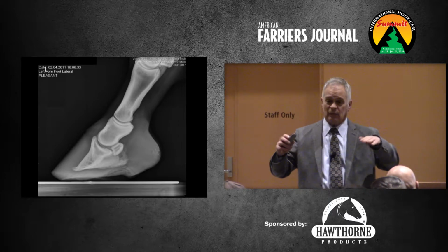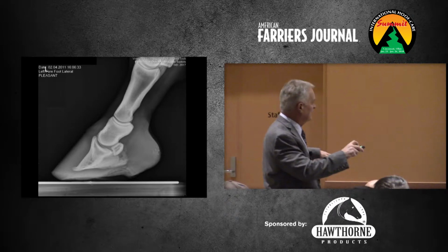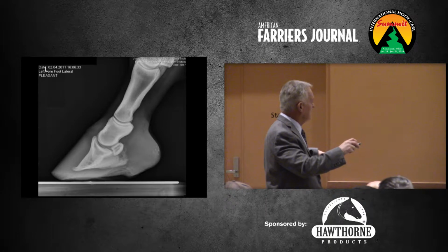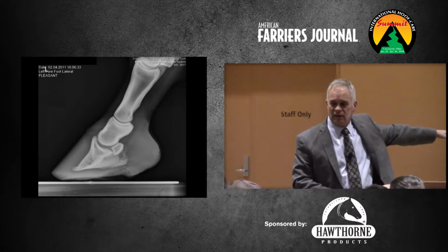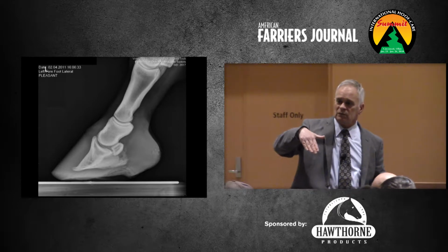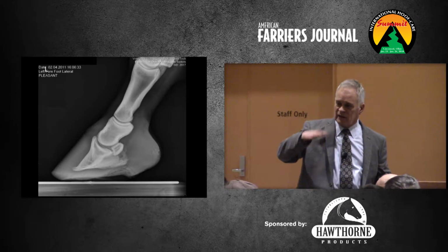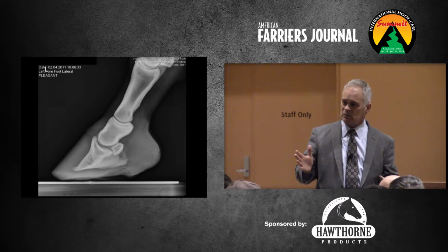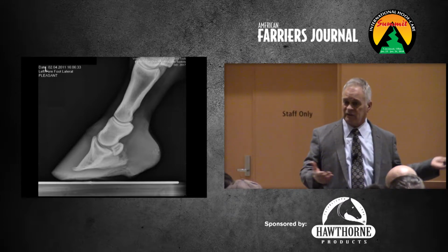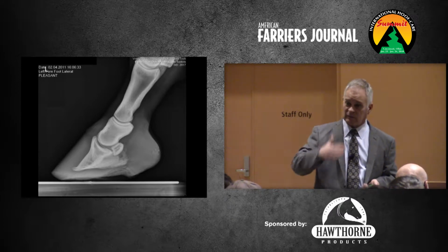And we know every time, there's no doubt, I don't want to get up here and make you think, this is after a trim. What do you think she's like in 6 to 8 weeks? She'll go up, and that's why you guys learning that growth pattern, you learn, okay, I've got to take this much more heel than toe. And a lot of these horses, you never take their toe except from the front.